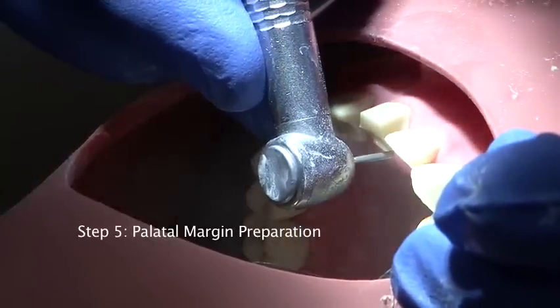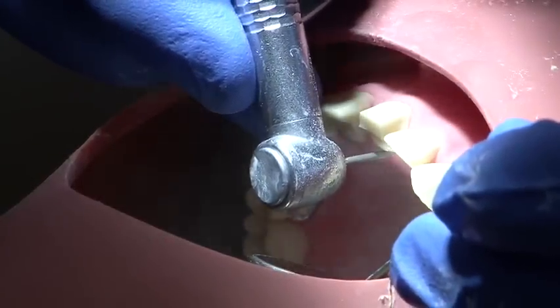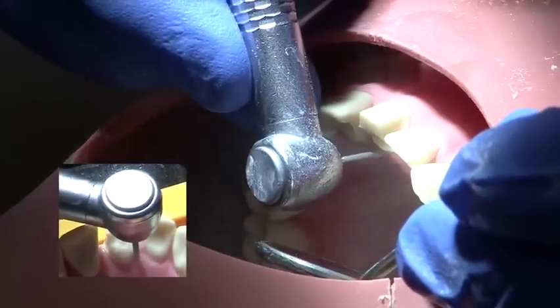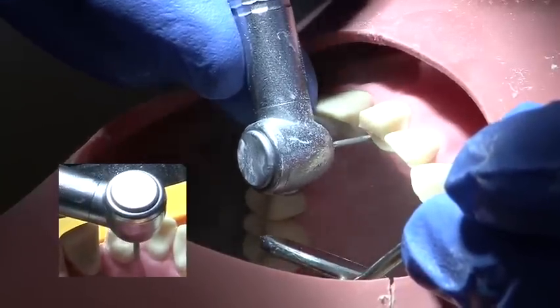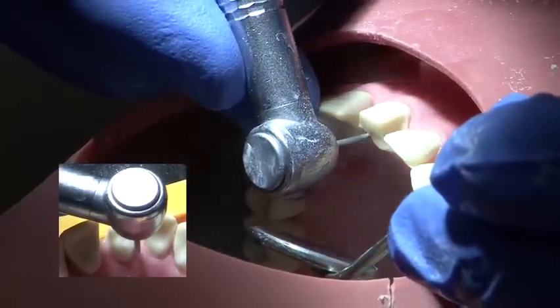The palatal margin is carried out to a depth of 1-1.5mm. It is essential to retain the natural cingulum of the tooth, so the palatal preparation must be parallel to the buccal preparation at gingival level.